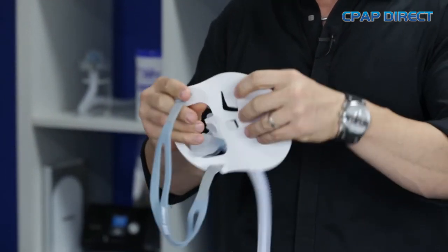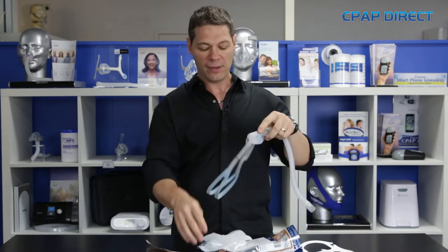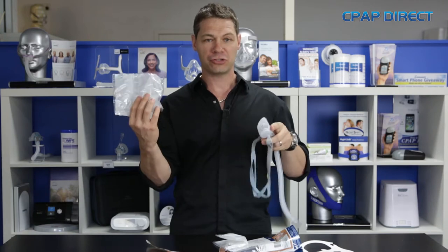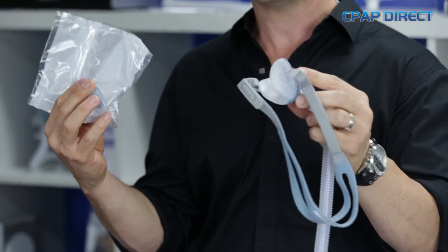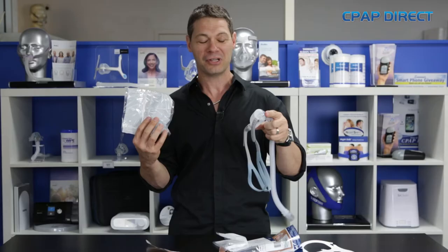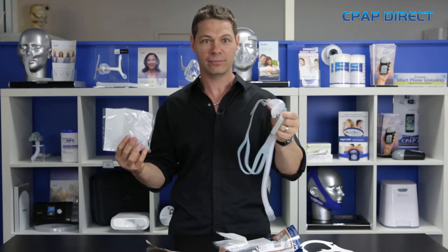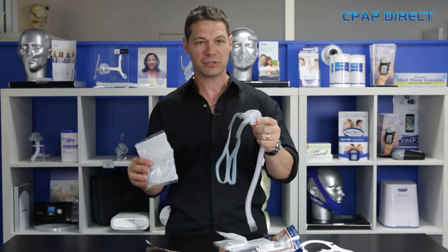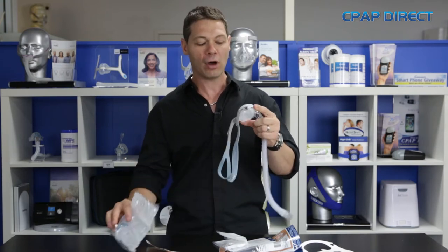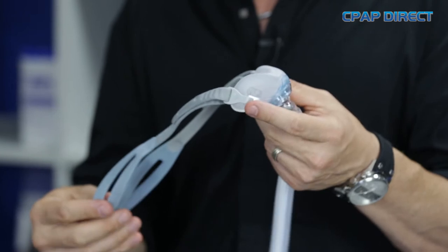The initial Polaro only had one cushion or one pillow, which was a one size fits all. In the packet, you get an extra small/small and a medium/large — two different sized pillows. Interestingly, I've got some pretty decent sized nostrils and I would have thought the medium/large was right for me. However, I get a better seal from the extra small/small. So it's important to try both to find out which fits best. It's quite a loose fit and doesn't push up on the nostrils like a lot of pillow masks do.